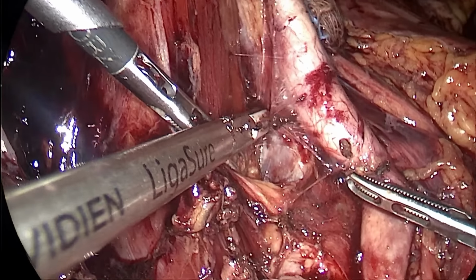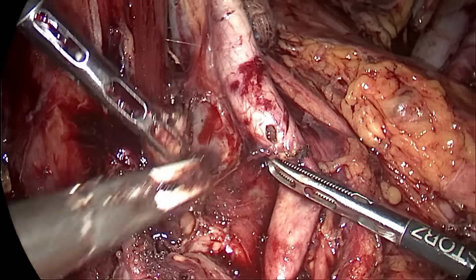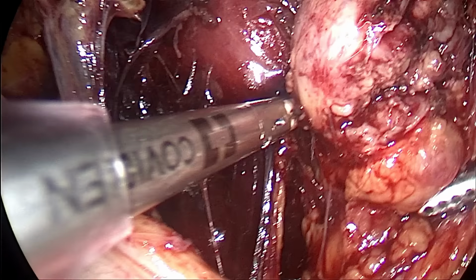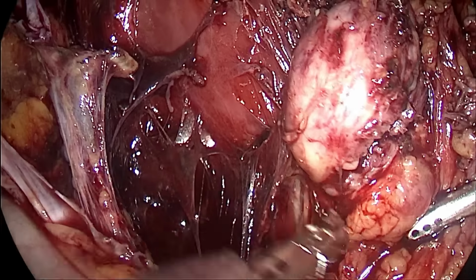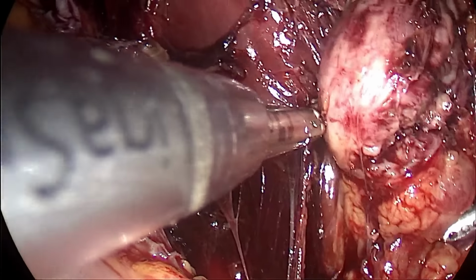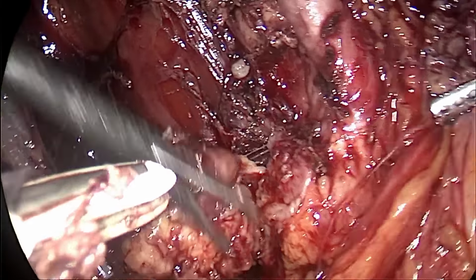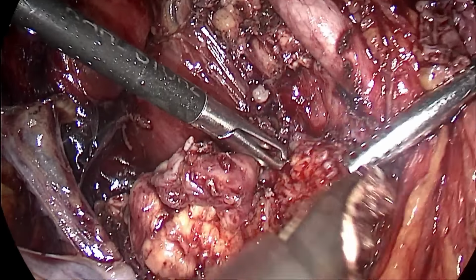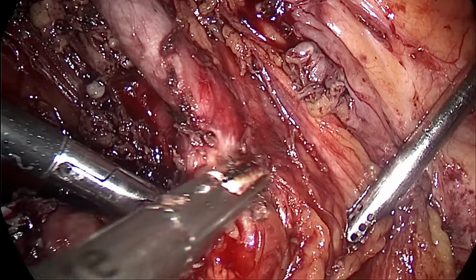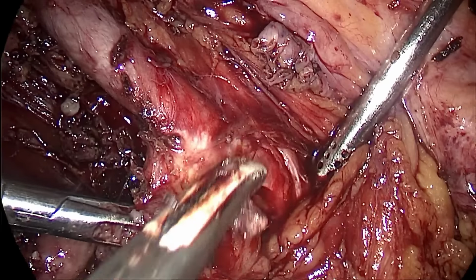That's the vein coming up below the artery. So now separating the node from the psoas major muscle. That's a large node. So in this part, the node is very much stuck with the vessel, you can clearly identify.